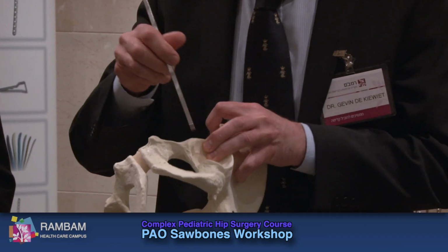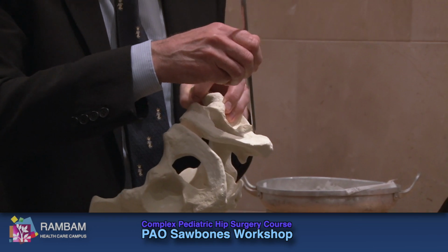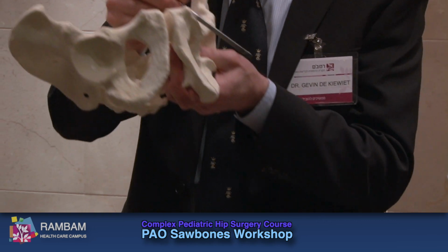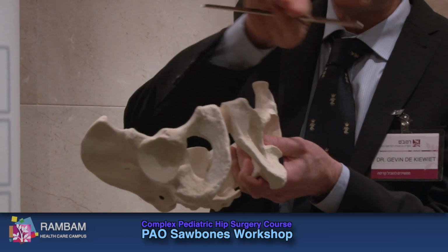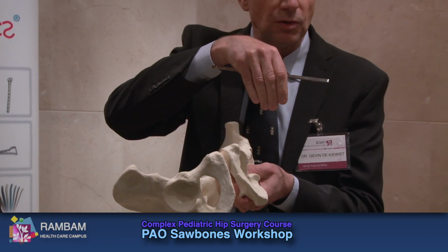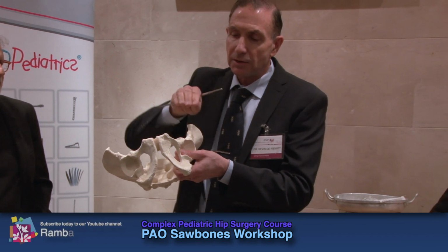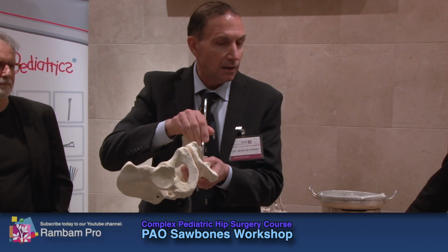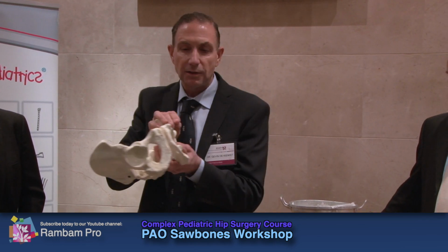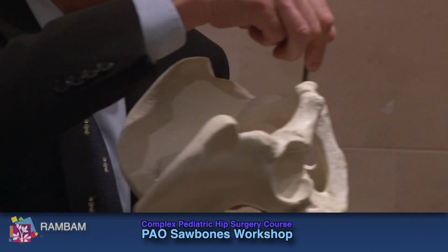You then need to find this part of the ischium, right? The infracotyloid notch, which is down here. To do that, you find your iliopsoas, you go into the bursa, and you open the bursa up and you just track iliopsoas all the way down. You pull the capsule towards you, keep the capsule closed at this stage, don't open it. You pull the capsule towards you and go down this side. You take your scissors and you go parallel to the pubic ramus. Take your curved scissors and do that. You'll automatically hit the ischium underneath that.